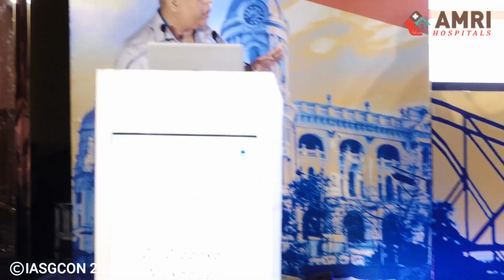If I'm honest, I started doing normal fundoplications with robotic. And actually, I don't make any distinction at all. You can say that if you've got fixed hiatus hernias, then you probably should not start with those. No, actually, it is easier. Once you've got the knack of handling the robot, it is actually easier for those reasons that I have said.